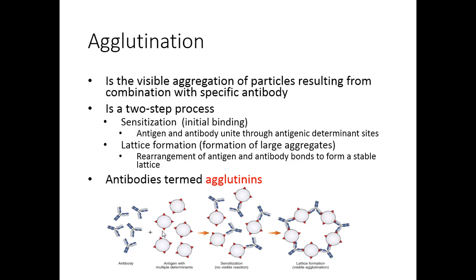Let's look just a little bit more closely at the agglutination reactions. As I said, agglutination reactions utilize soluble antibody binding to a visible particle, a red blood cell, a bacteria, an inert particle, right? In order for the antigen to bind with the specific antibody.